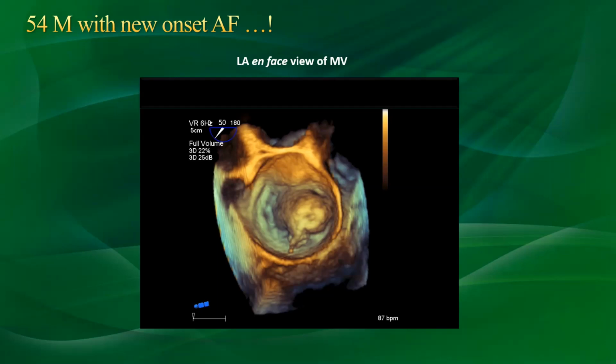Okay, we have 51 responses so far out of 95. We need more responses. Come on, guys. Okay, I think we'll take that. Okay, so at least now more people feel this is an A2 problem, right? Most of us don't think this is P2 anymore. And now the disagreement is whether it is a prolapse of a leaflet.